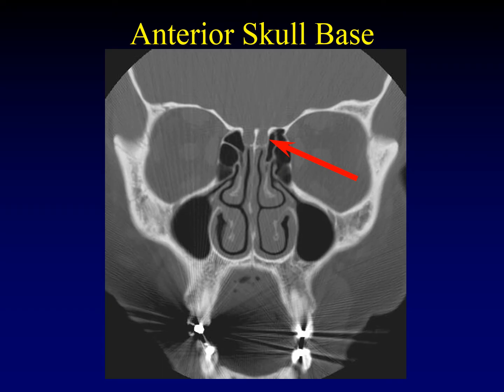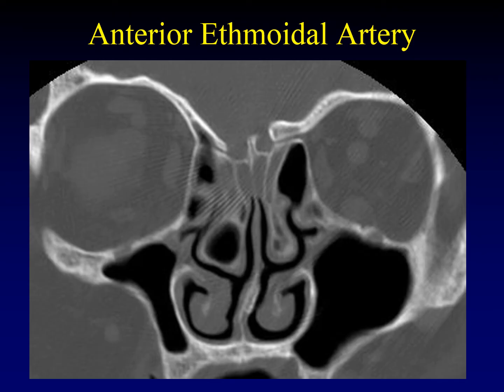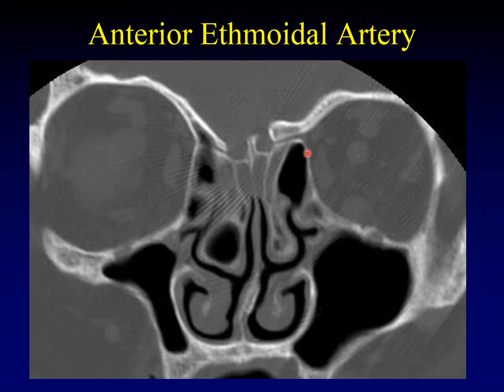The lateral lamella normally has a couple of defects for the anterior and posterior ethmoid arteries, so not all gaps in the lateral lamella are abnormal. Right down the center is the crista galli, which separates the two olfactory grooves from one another. There is a normal gap in the lateral lamella for the anterior ethmoidal artery. The anterior ethmoidal artery runs from the orbit, through the ethmoid air cells — sometimes just above them — across the lateral lamella and into the olfactory groove. It's usually most evident as it pierces through the lateral lamella.